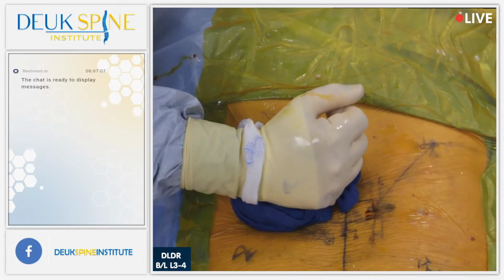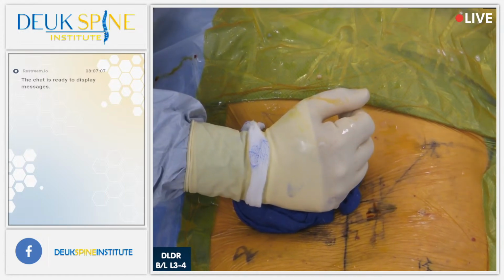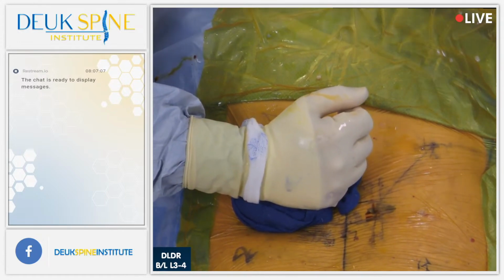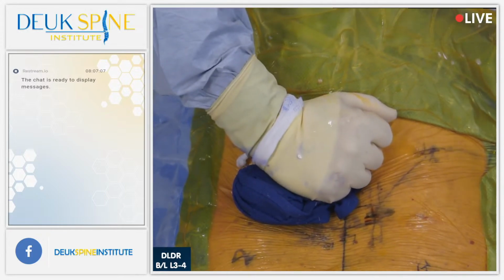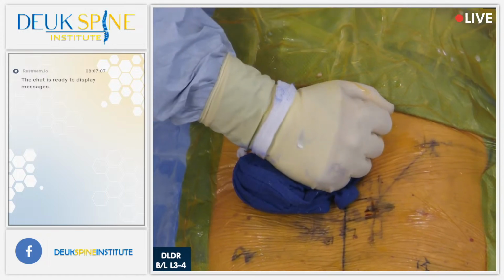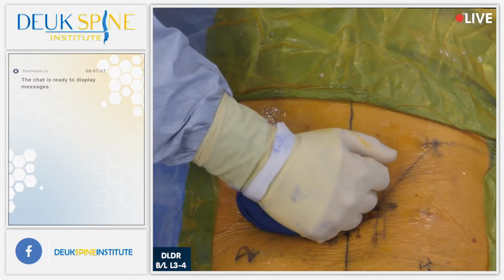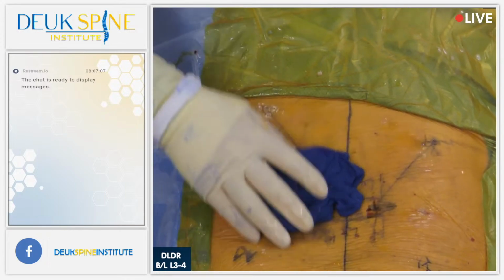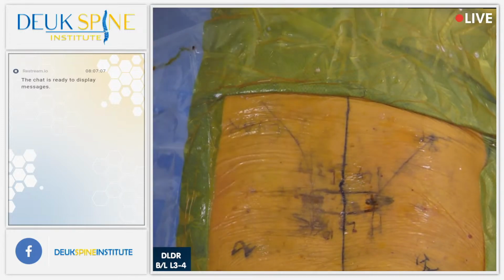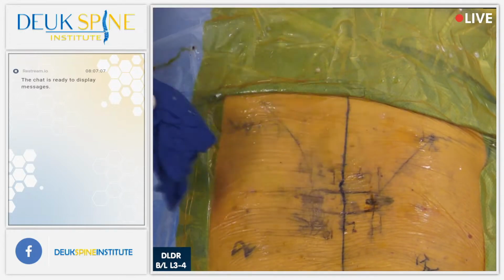So just to remind you, this is the dilator. You all see this? Yes, we do. So the tip here, this tip, spreads fibers apart. Fibers, okay? We're not cutting the muscle, we're spreading the fibers. But sometimes you'll get a little vein in there that gets torn, and it can bleed. And the other thing you have to do as a surgeon is make sure your anesthesiologist keeps the blood pressure around 110. Systolic, you don't want to go over 110. Maybe 120 is okay, but you want to keep it around 100 to 110. Systolic, okay? And the reason is if you let the blood pressure go up to 190 or 180 or 170, then you're going to get more bleeding.